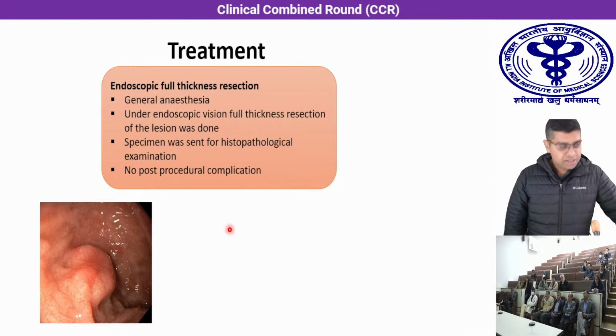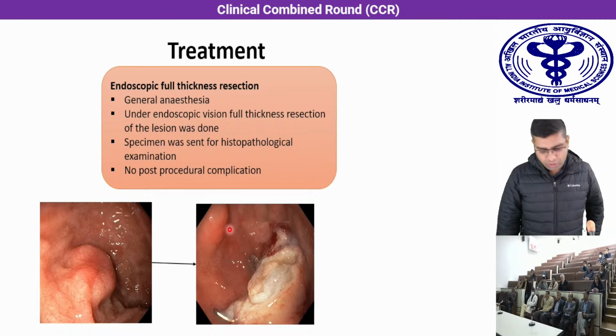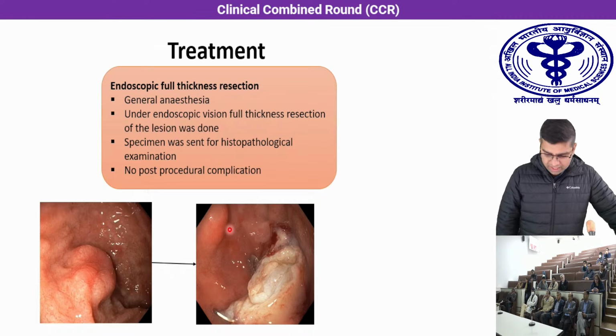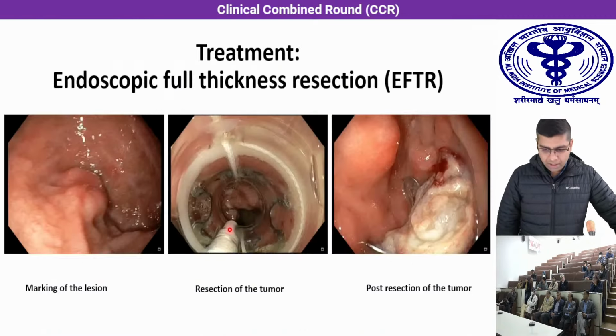This is the image prior to the endoscopic full thickness resection. With the technique of endoscopic full thickness resection using the full thickness resection device, post resection we can see the closure device and its clamps, which are seen surrounding the resected area. This is the resected specimen showing grossly all the 4 layers of the duodenal wall.